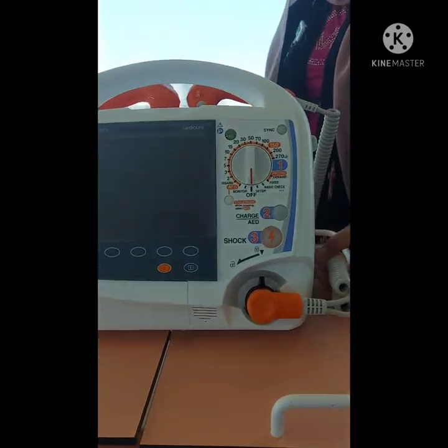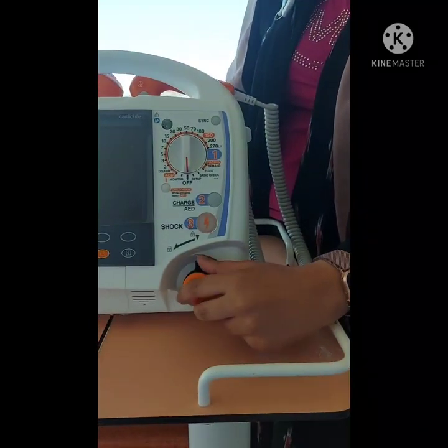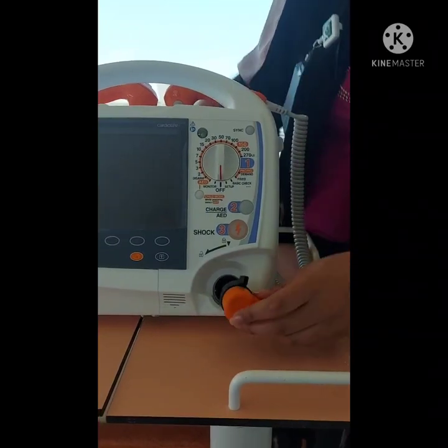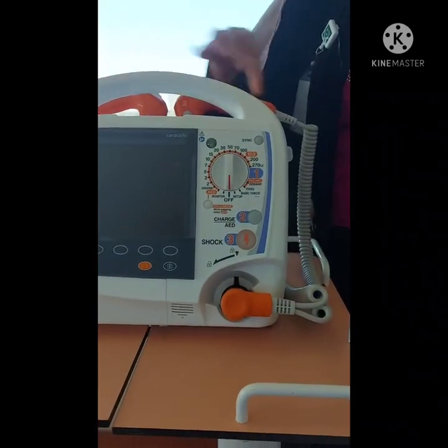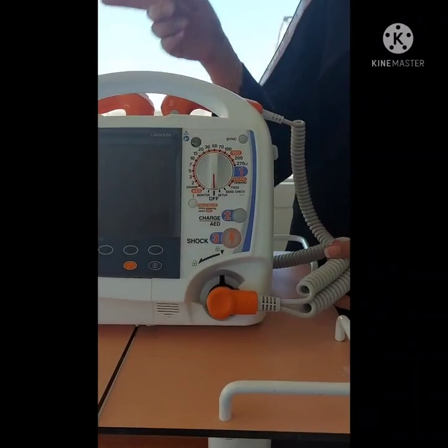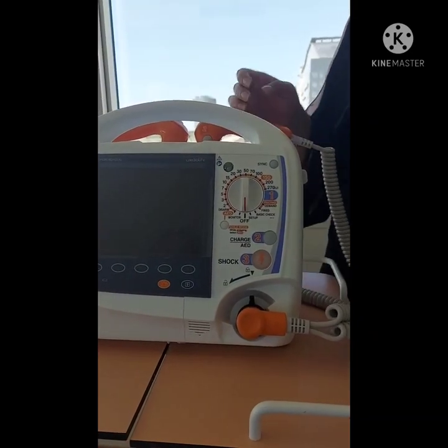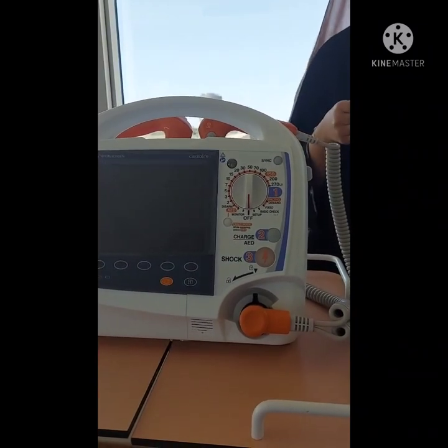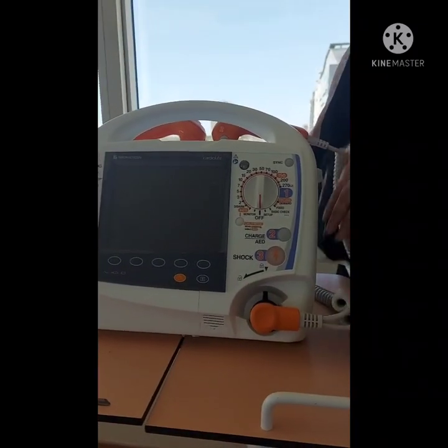Here you have the cable for the paddles and you can disconnect it by clicking on the other side. When you want to put it back, you just have to press and hear the click. We have another cable, in biomed, for the disposable pads. It's exactly the same as this one, but at the end it can be connected to the disposable pads. You attach it the same way.